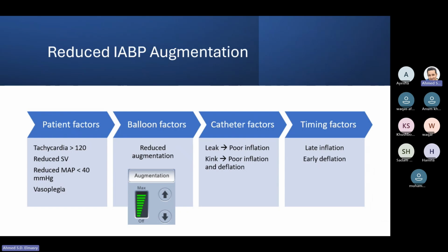Anyway, the idea is to wean, whatever the method of weaning, and to monitor the patient for the hemodynamics, the oxygenation, the lung water index. There are many parameters clinically that will give you the impression whether the patient is okay or not. So if the patient is tolerating the weaning, whatever the method, you can carry on. But which one is the best?